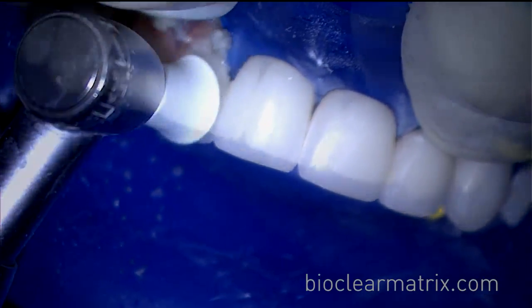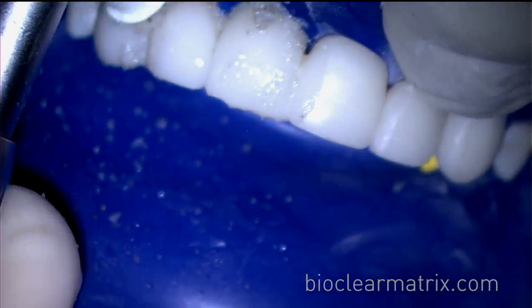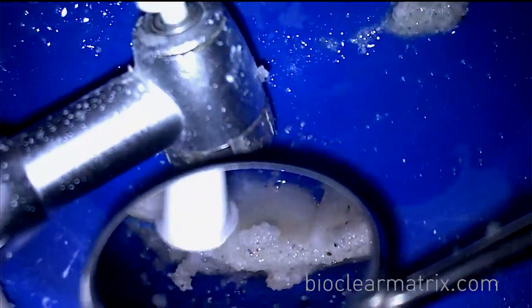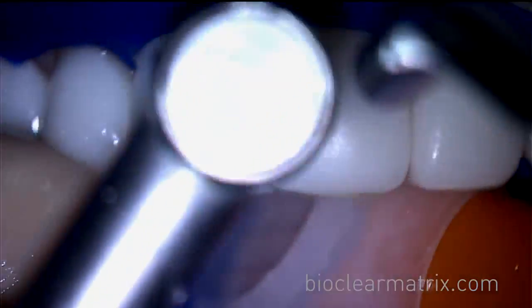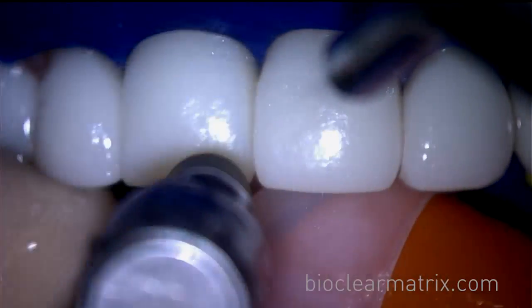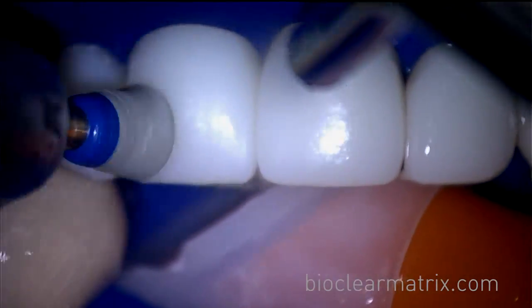Step 2: Use coarse pumice in a disposable profi cup to create a matte finish on the composite. Step 3: Use the jazz polisher with water and heavy pressure. This will create the long-lasting high shine polish.